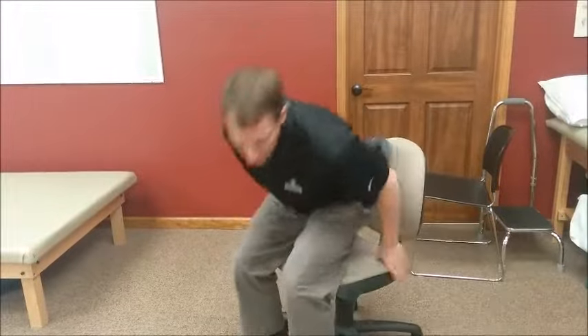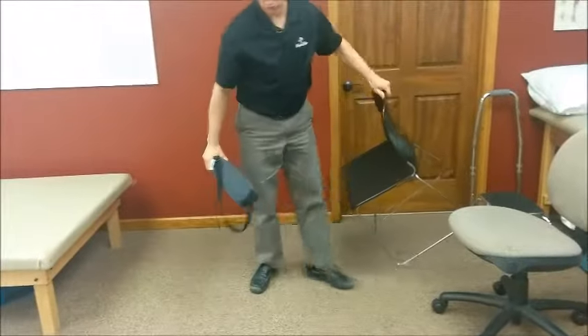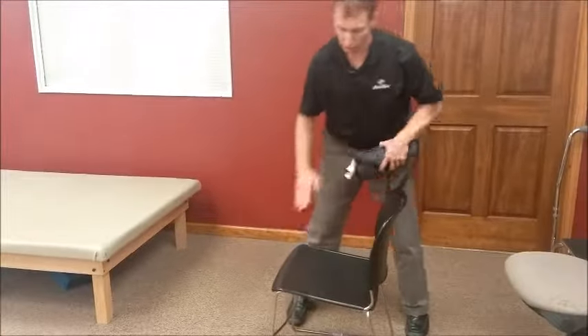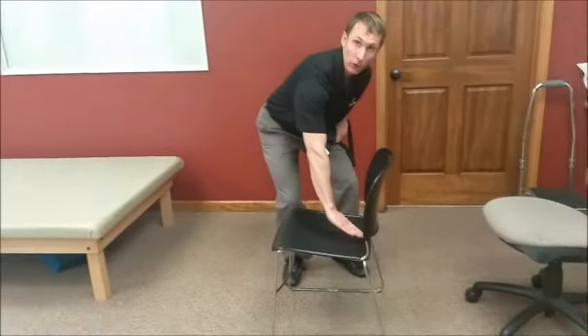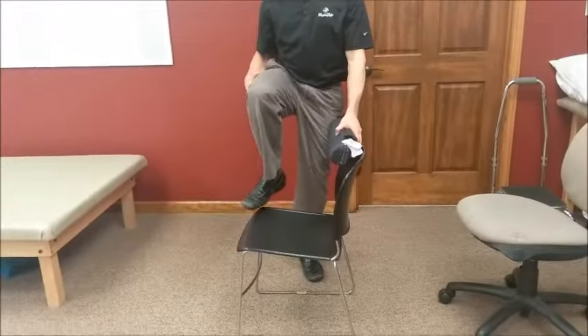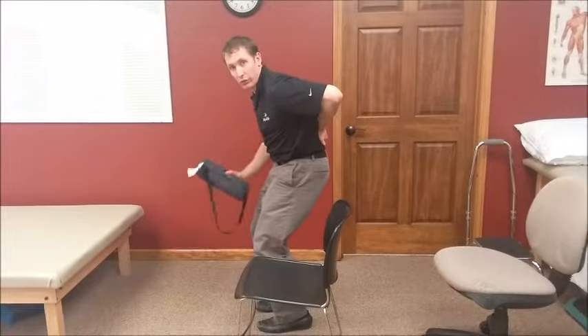I wanted to show this in two different chairs. What you see in a lot of cases, with car seats especially or some chairs like this, is that the tail of the chair is slanted downward. That's going to put your knees higher than your hips, which is actually going to cause you to sit in this rounded position, which we're trying to avoid.